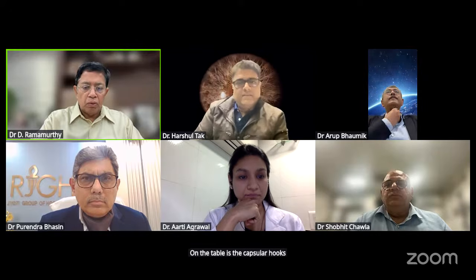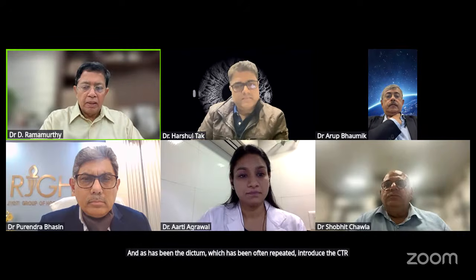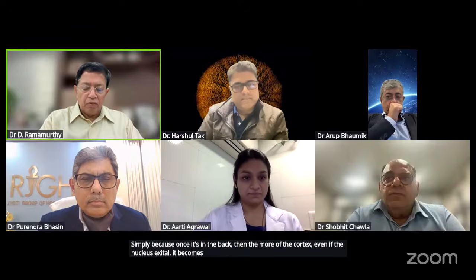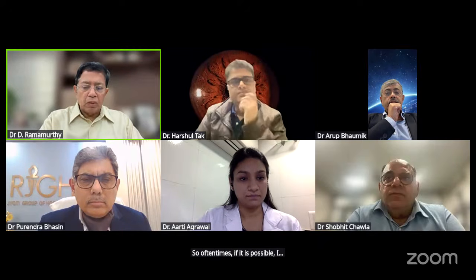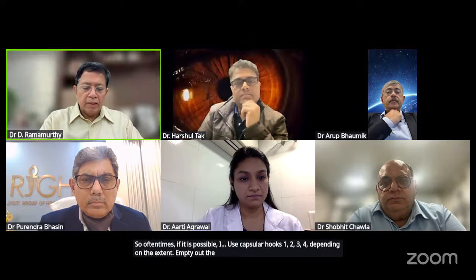And as has been the dictum, which has been often repeated, introduce the CTR as late as possible, simply because once it's in the bag, removal of the cortex, even epinucleus, etc., becomes a little more difficult. So oftentimes, if it is possible, I use capsular hooks, one, two, three, four, depending on the extent, empty out the lens material, and then subsequently use the endocapsular ring to circumferentially support the zonular support that is there.